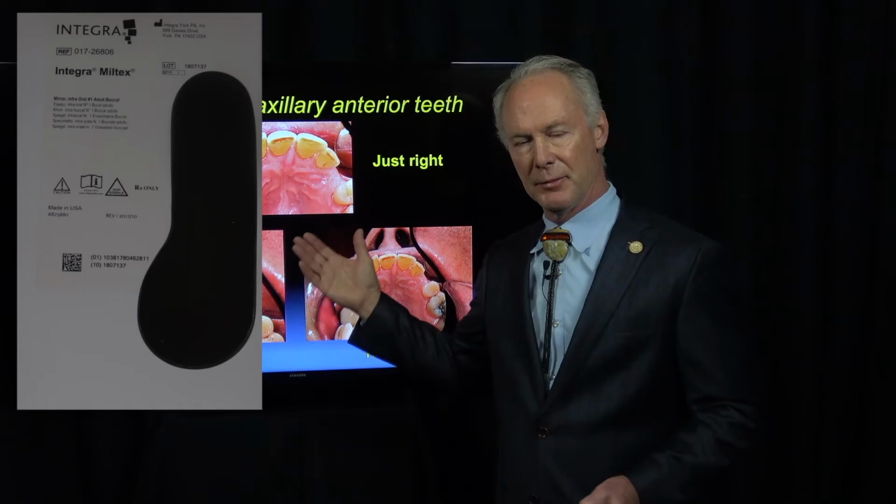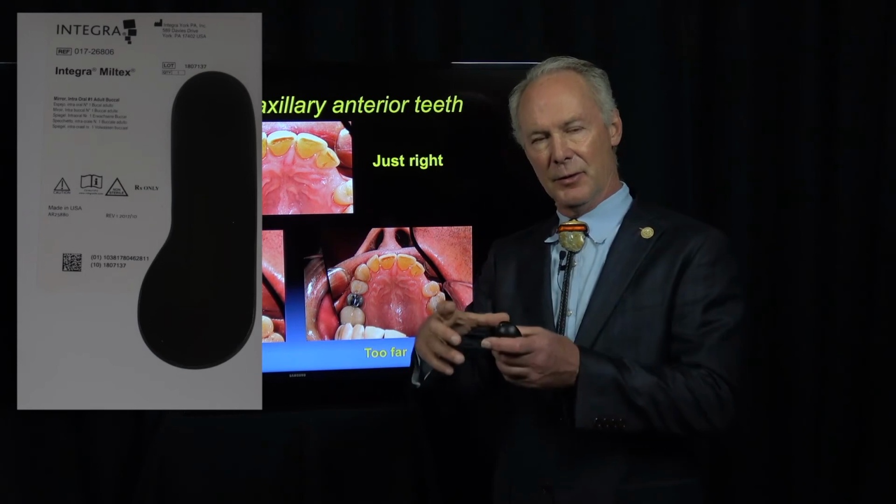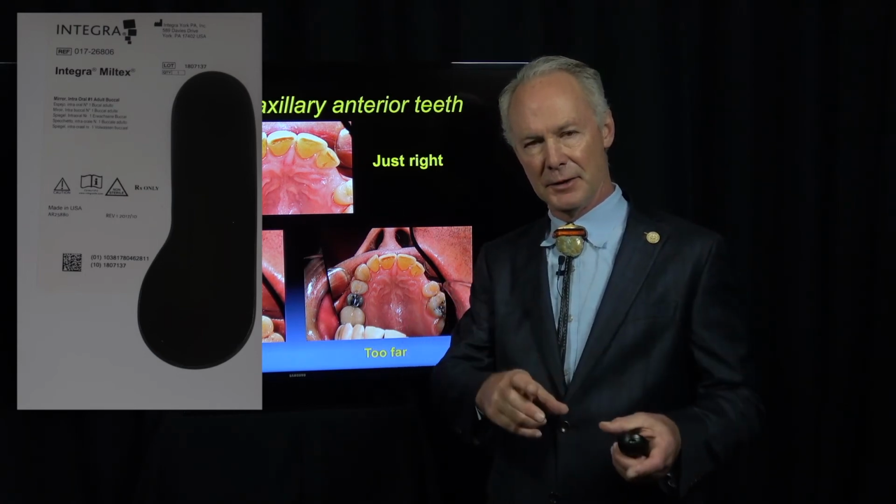All these pictures are taken with either a thin occlusal mirror or a large occlusal mirror. Most of them are taken with a thin occlusal mirror, which has a large end and a small end.